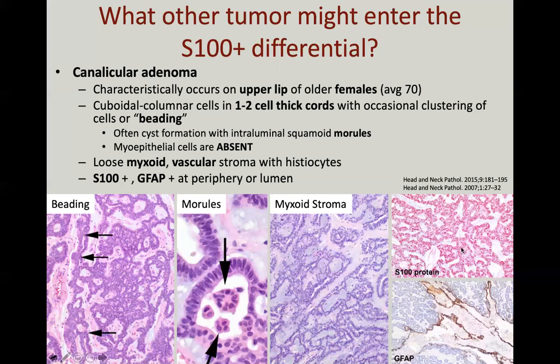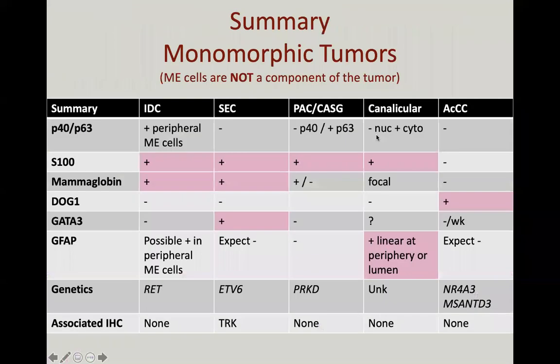These are also, as you can see, S100 diffusely strongly positive, and sometimes have been shown to have a weird GFAP-like luminal staining pattern. So just mentioning that so you know that this is out there. It's very rare, but really think of it in this clinical context. Okay.